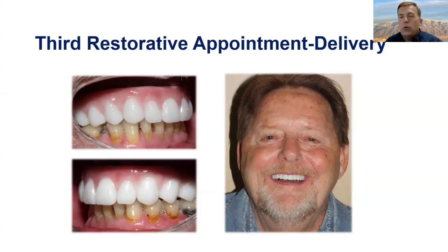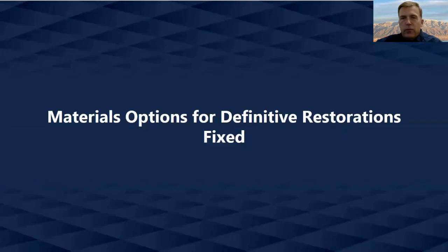You want to make sure that you give them good instructions on hygiene and also set up a recall appointment based on how effective you think they're going to be. It's a good time to talk about costs if you're doing like a 4-locator case or something like that, replacement schedule and things like that. If you have a fixed, talk about what your screw replacement schedule is. Some people like to do 2 screws every time they take it out. Current best practices is leave the prosthetic in unless you can't clean it. So today, most people aren't removing fixed if they don't need to be removed. And then have an early appointment, just to evaluate hygiene and do some coaching.